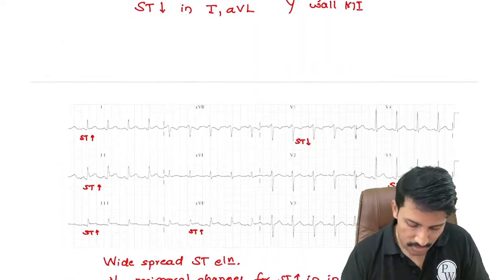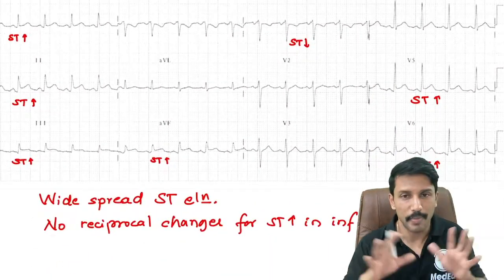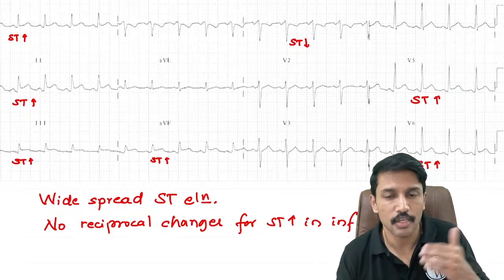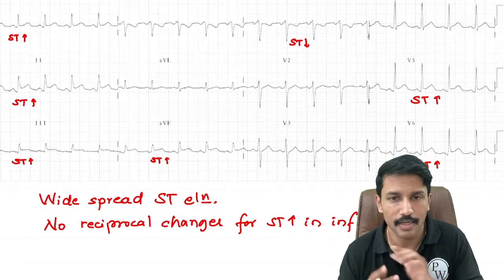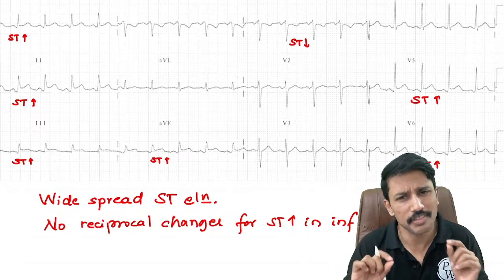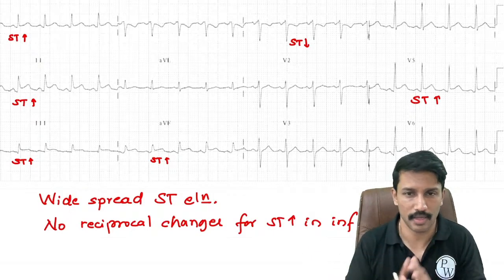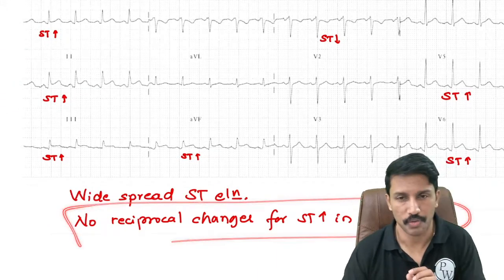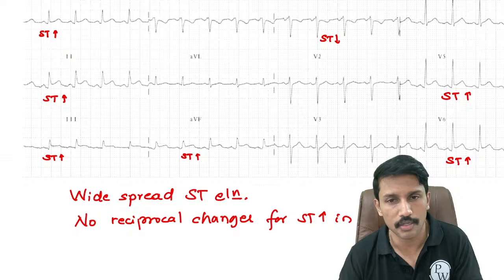Now this ECG that we saw, which was not typical, the pattern was not fitting into it. This is actually a patient with acute pericarditis. In acute pericarditis, there is widespread ST elevation in multiple leads, which does not follow the rule of reciprocality. Like we saw here, there is no rule of reciprocality being followed. In fact, we see 3 changes in acute pericarditis.